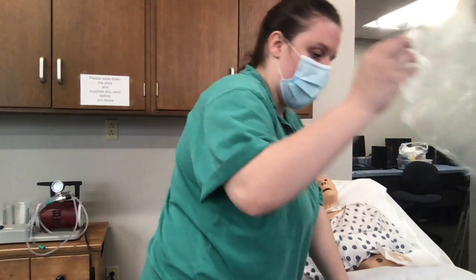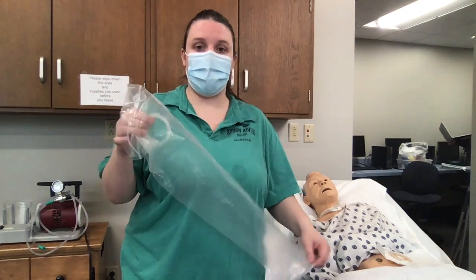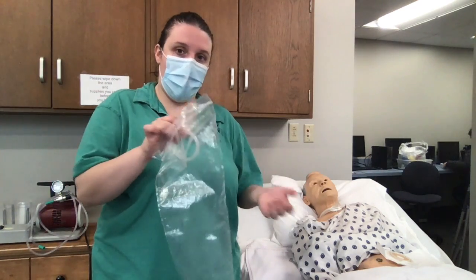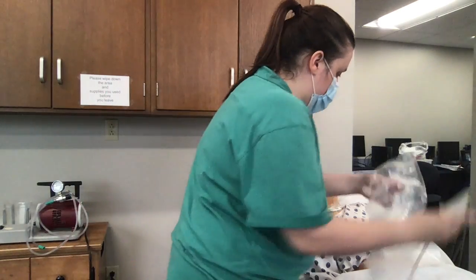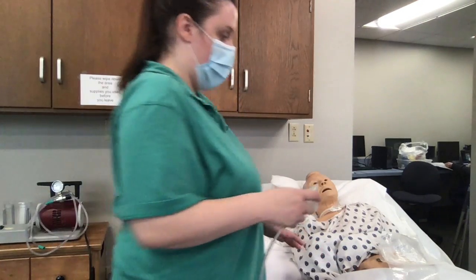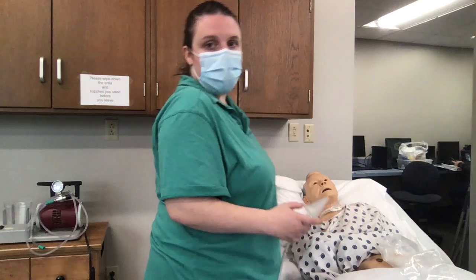And then I'm going to take my irrigation bag. I'm going to make sure that if the patient is able and they want to, I can set them up on the toilet and irrigate over the toilet. But if not, I've got my irrigation bag that I can hook up, and I can put a bedpan close by. So I've got my irrigation bag, and I'm putting the end of it into that bedpan.